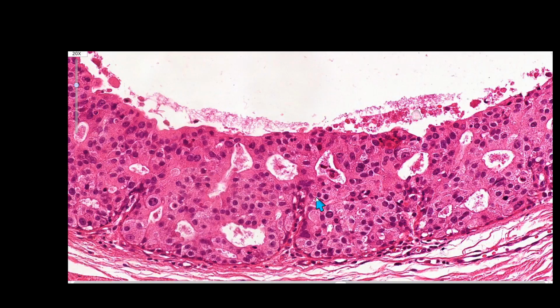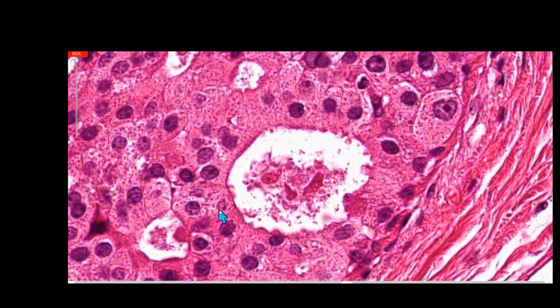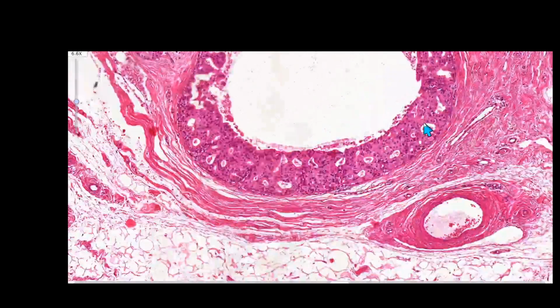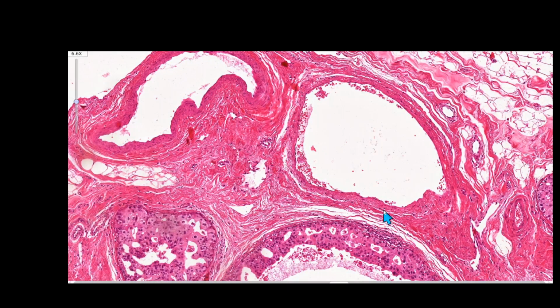On the 4 micron histology section, they look like holes, but in 3D pathology, these are spherical cavities. The cancer cells produce fluid and they fill the spherical cavity within which some psammoma body-like calcifications may occur. They result in the pearl-like calcifications on a mammogram.